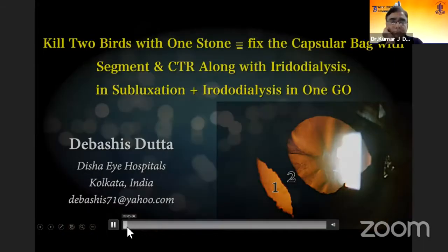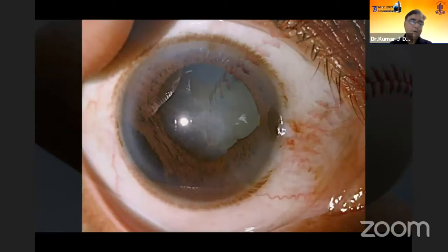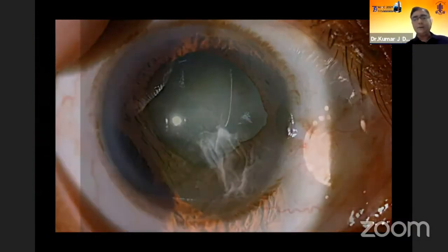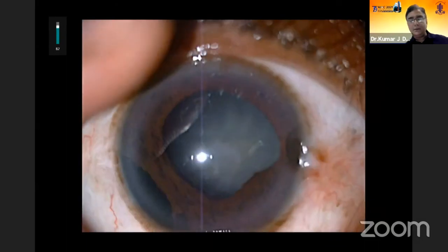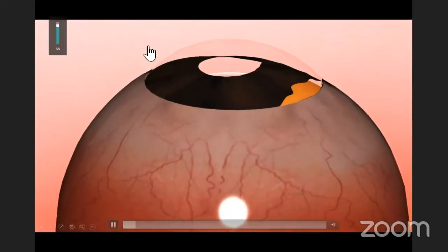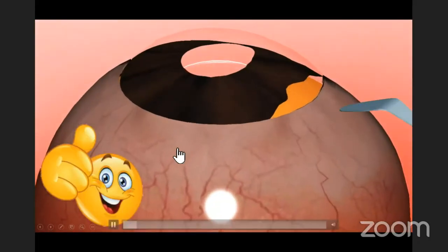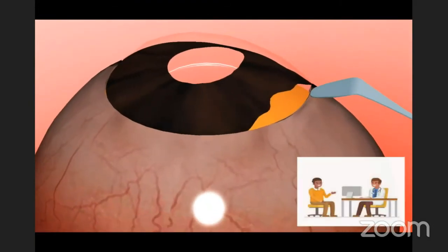A patient with blunt trauma developed 3 clock hours of iridodialysis and zonular dialysis, and thereafter a significant cataract. Your case is a bit complicated, and the literature also does not help much. But don't worry, I have a new idea to fix both the defects at one go. Let's discuss what we are going to do.